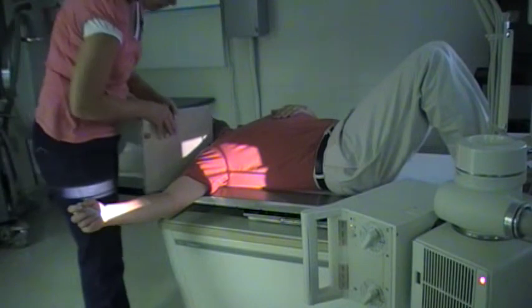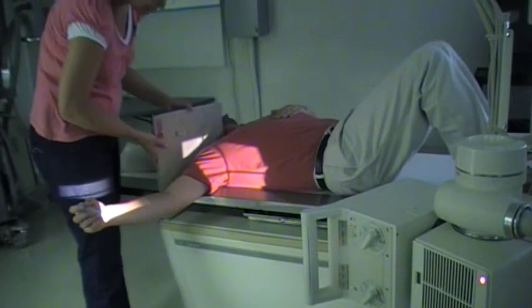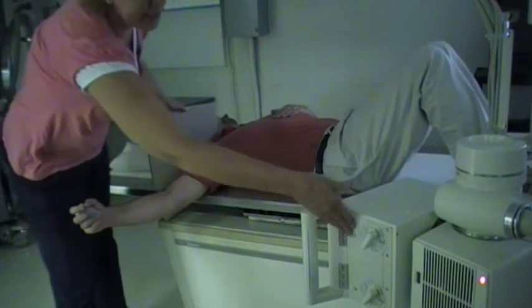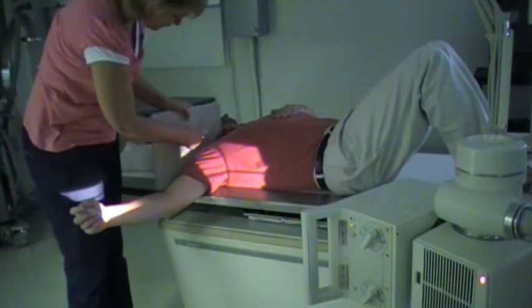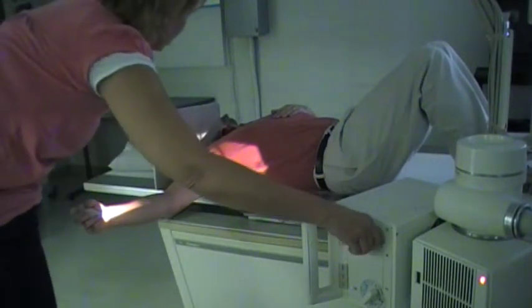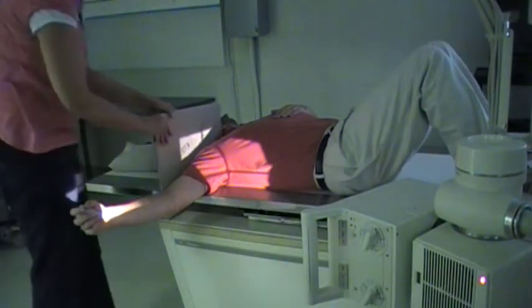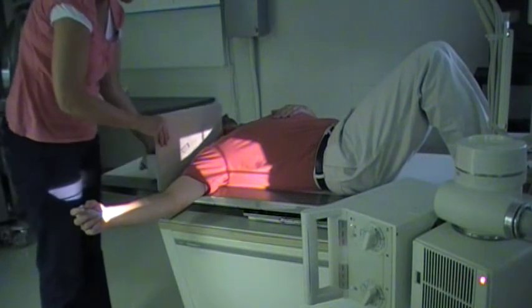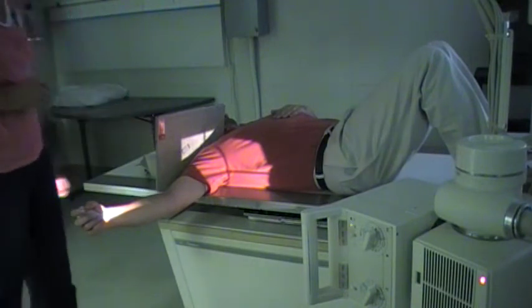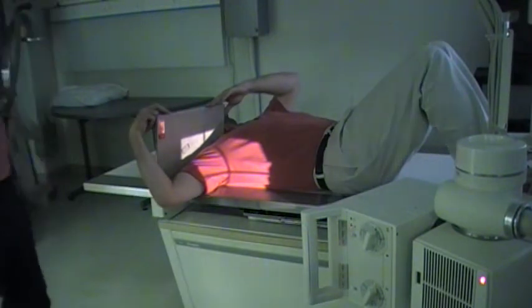Prop the IR right beside the patient, with this edge going right into the patient's neck. Open the collimator light just enough so that you can see that the central ray is going to be on the IR. You can prop the cassette by putting a weight — I've got a sandbag directly behind there. I have had patients that were able to hold it and do it that way as well.